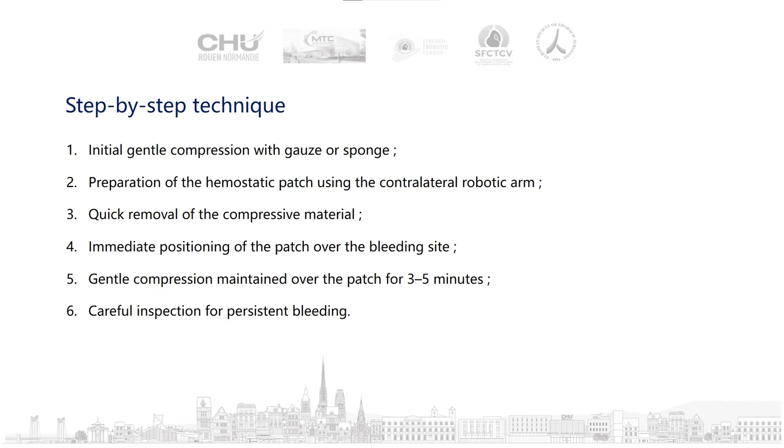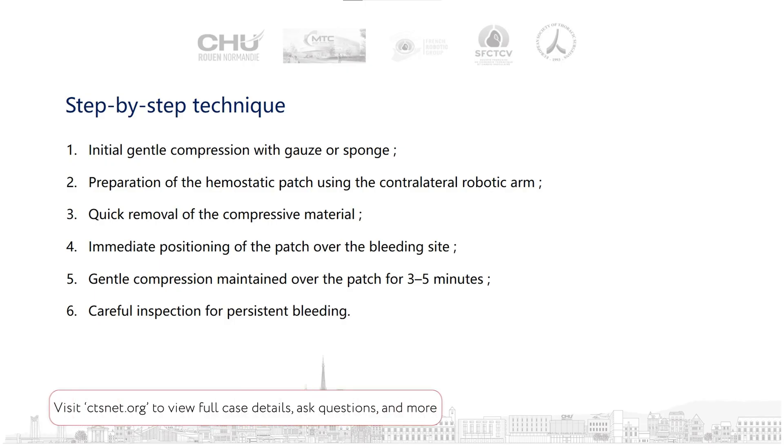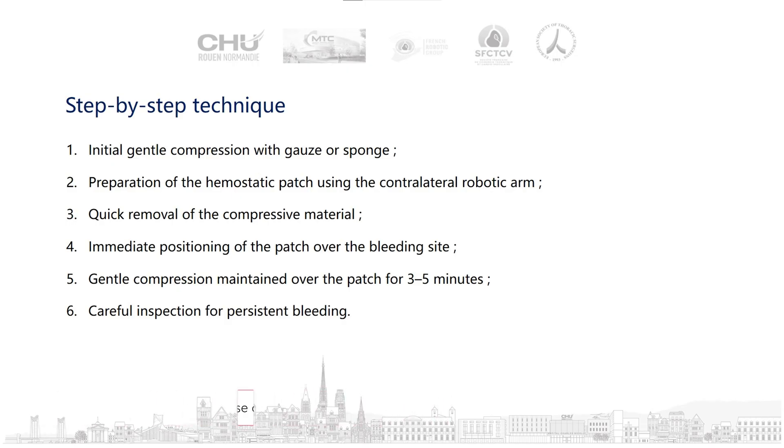Our step-by-step technique starts with compression using a gauze sponge. We then prepare the hemostatic patch using the other robotic arm, followed by quick removal of the compressive material with immediate positioning of the patch over the bleeding site. Gentle compression is maintained over the patch for 3 to 5 minutes, after which we perform careful inspection for persistent bleeding.